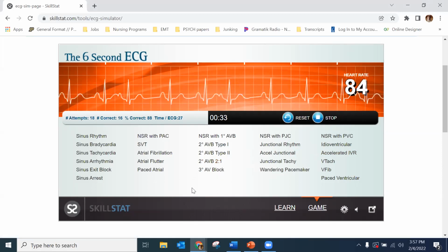That's like the dumbest heart block. Okay, here we go. So my rate is okay. If I go to march these out, my next beat should have come here. We start over, my next beat should have come here. And then these are all equally spaced.